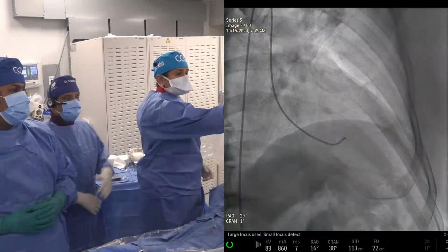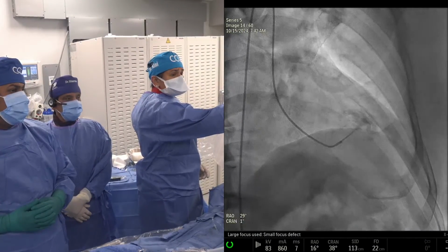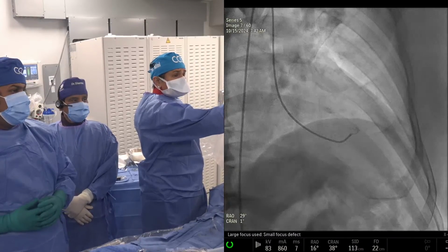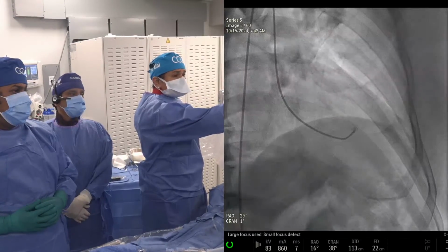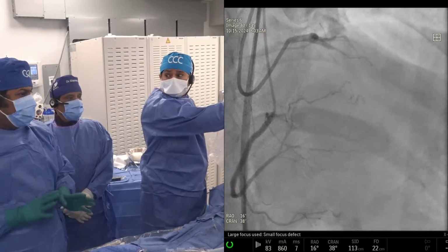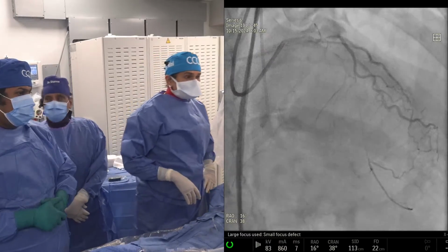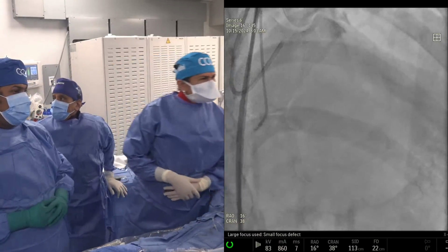This is okay. LV, show the LV was normal. Yes, normal EF. And this is the right coronary artery. Previous PCI there. No RCA injection. Oh, we didn't do. Okay. All right. So RCA looks good. The injection is there, but look at the LAD complexity. Calcium, long segment, and bifurcation.